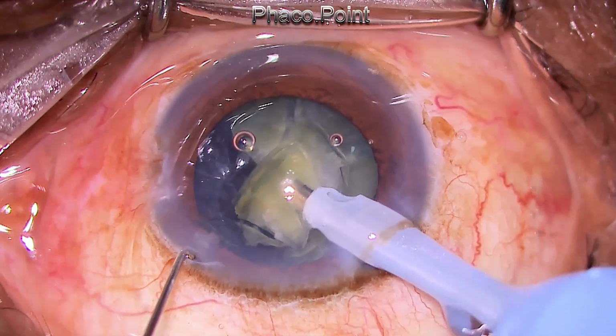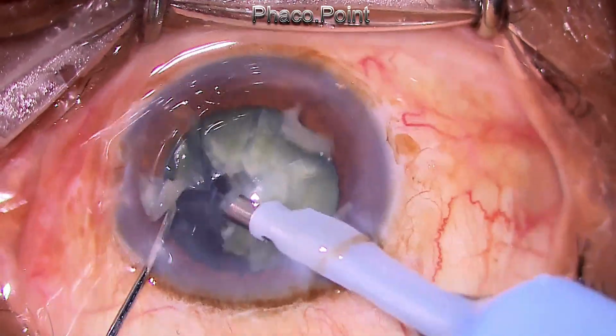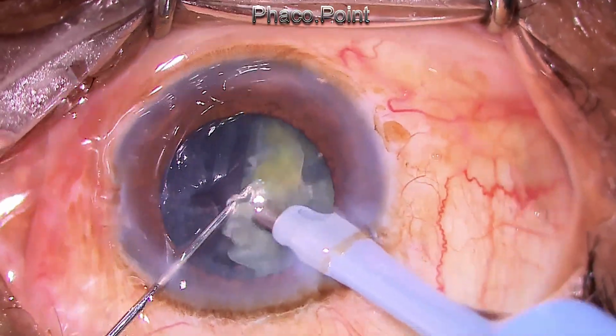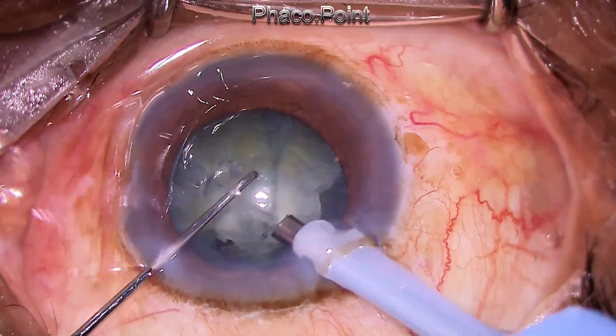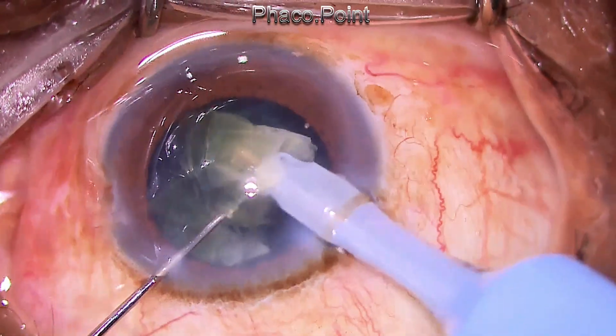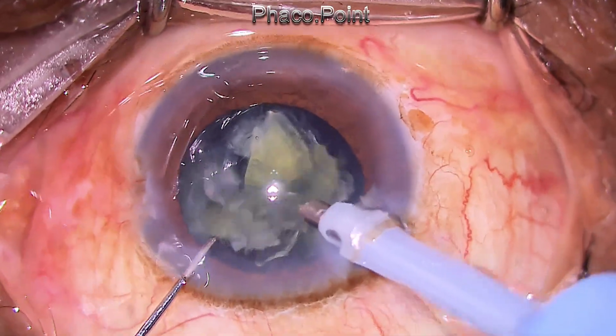In this particular case, there was no striate keratopathy and the cornea appeared crystal clear in the first postoperative day. Like in the previous case, the nucleus fragments are mobilized and brought to the central safe zone where they are emulsified. I'm just going to let it for you to observe the case carefully and see if you can make out what could be the main difference.